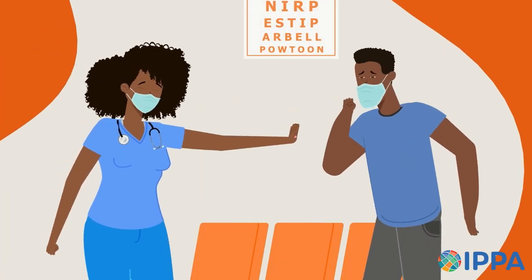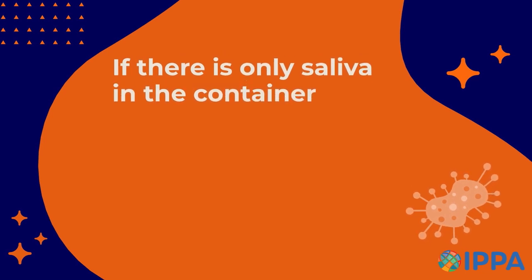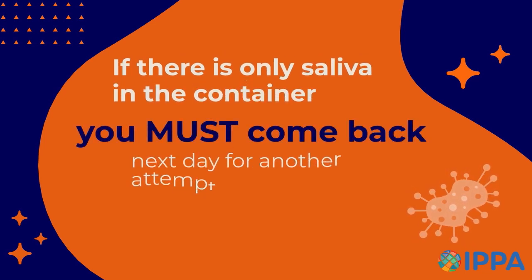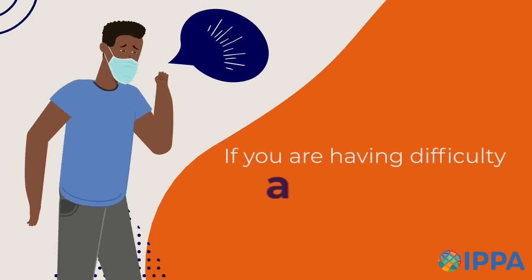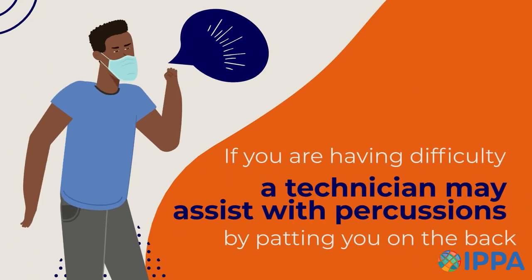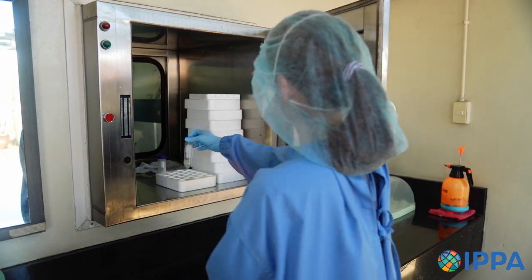The technician will tell you when you have coughed enough to produce a specimen. If there is only saliva in the container, then you must come back the next day for another attempt at collecting sputum. If you're having difficulty producing a specimen, a technician may assist with percussions by patting you on the back.